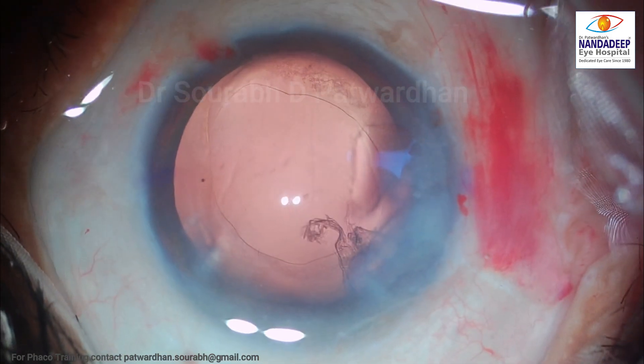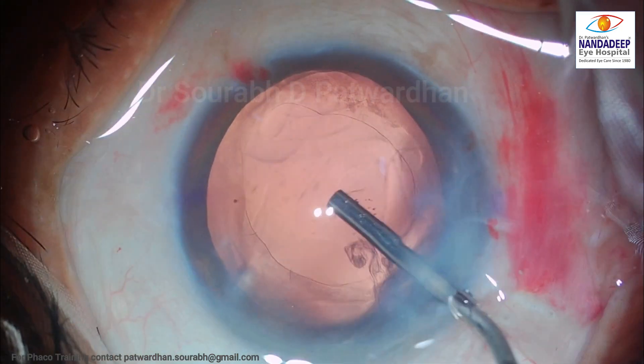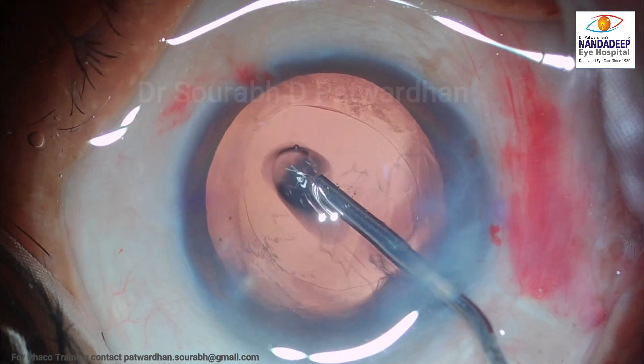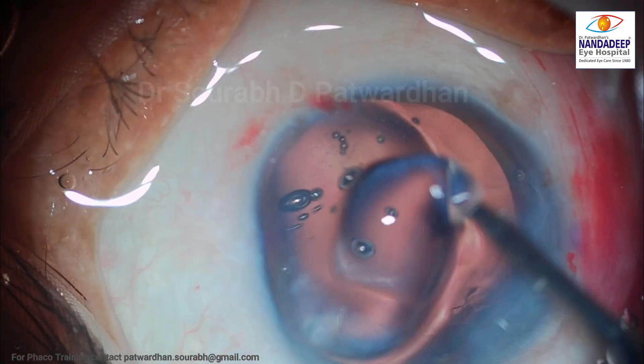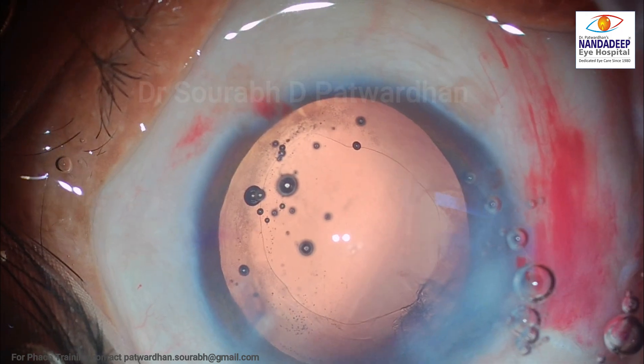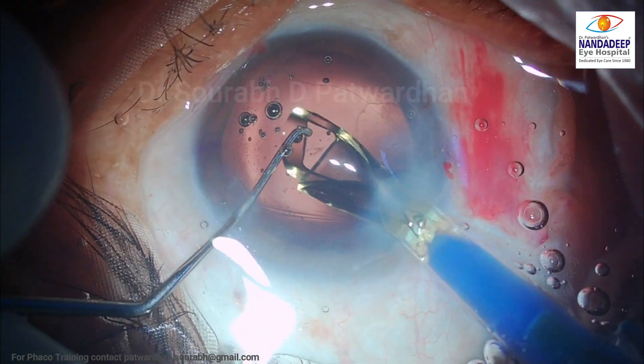So there is one option of doing bimanual IA here, but I don't want to make another incision. So I decide that I will put the IOL inside and use that IOL for removing the sub-incisional cortex. Let's see how I do it.